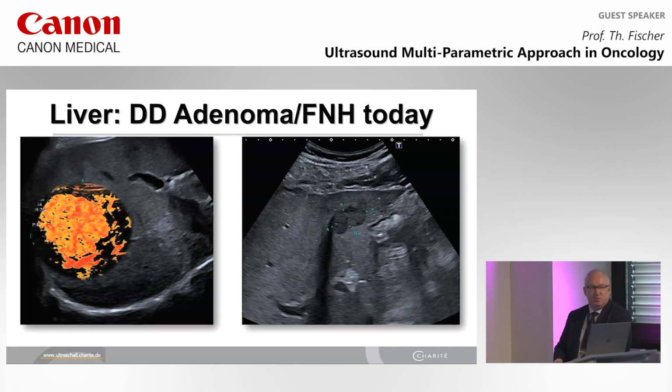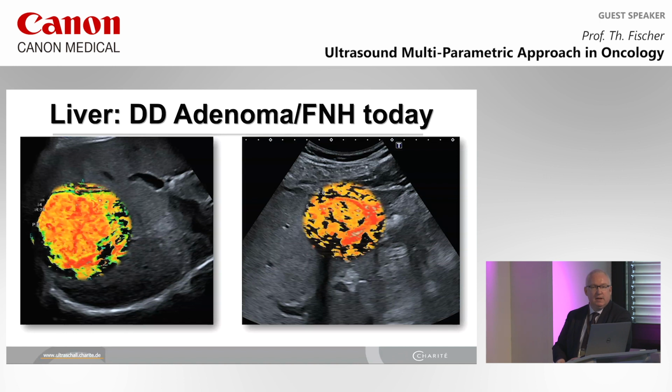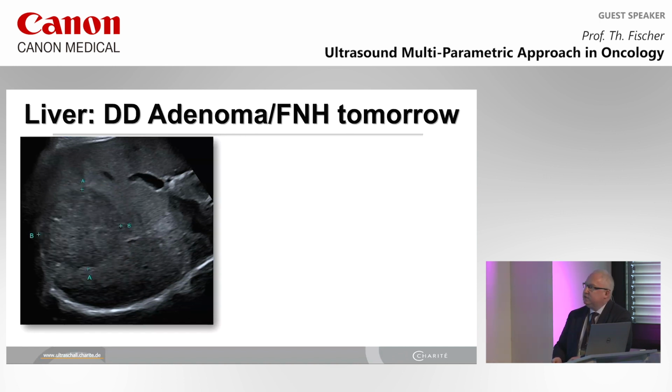FNH, you're right, perfect. And if this is an FNH, and I told you there is some adenoma, this should be the adenoma. Yeah? Okay, this is what we can do nowadays. But in the future, hopefully, we get images like that.